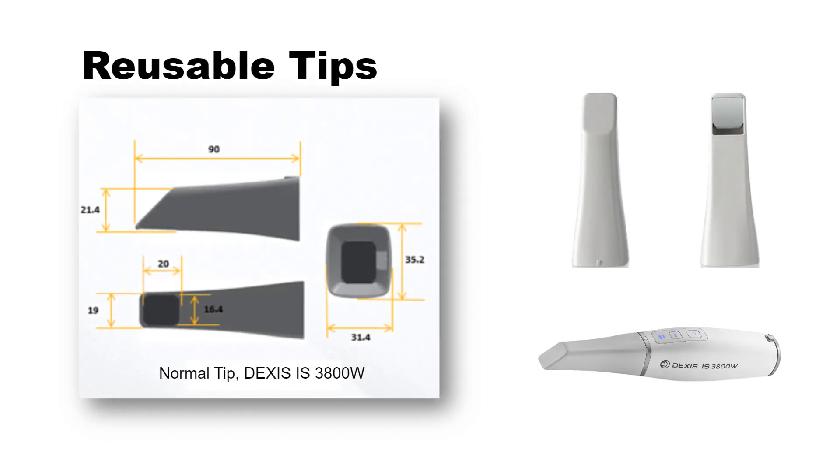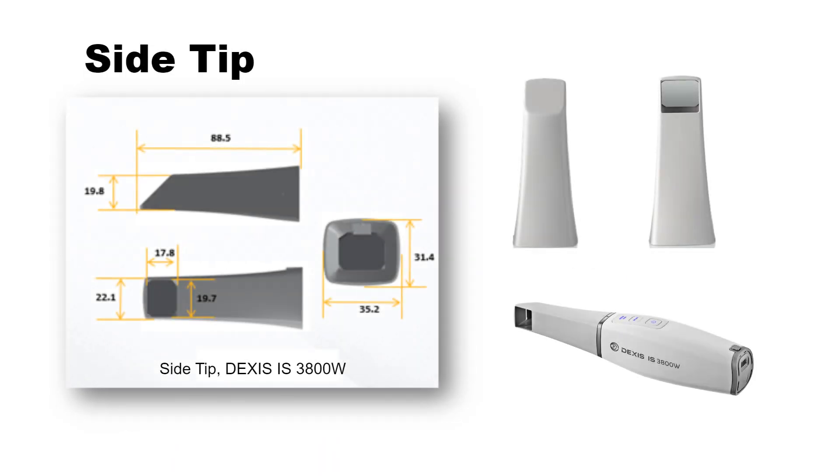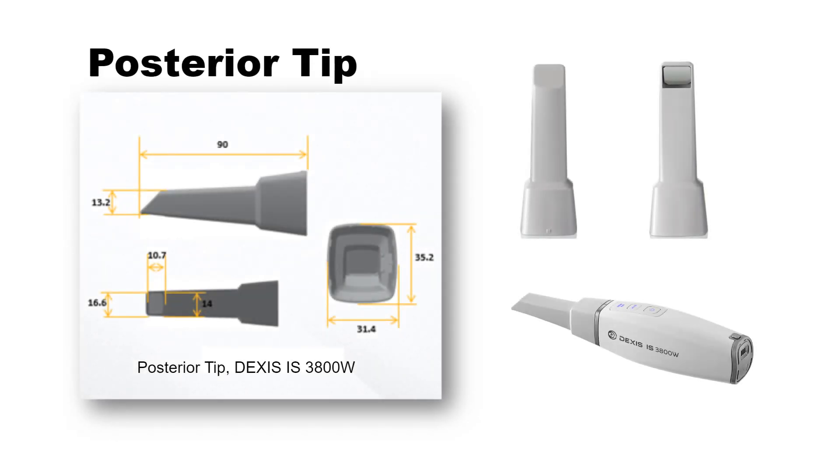Reusable Tips. There are three types of tips: Normal, facing downward; Side, facing left; and Posterior, facing downward. The posterior tip allows for more comfortable scanning in hard-to-reach areas. The posterior tip is designed for quadrant scanning only and should not be used to scan a complete arch.